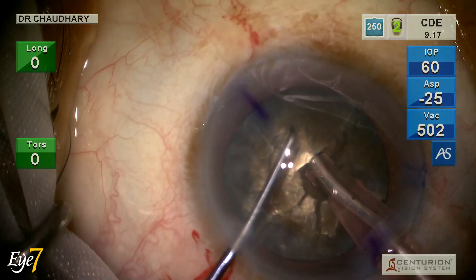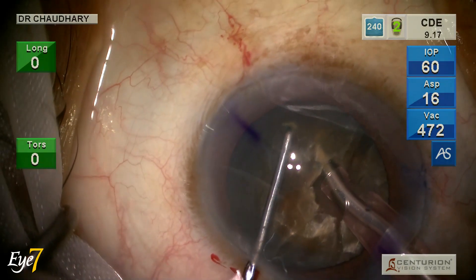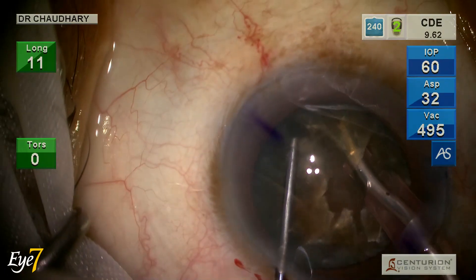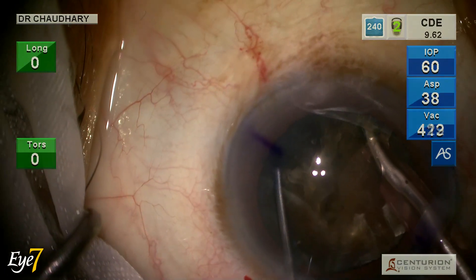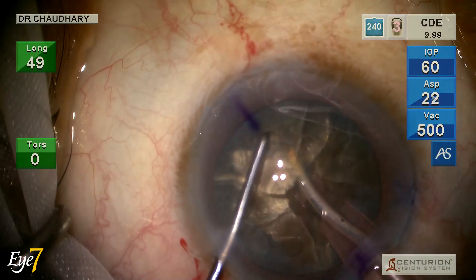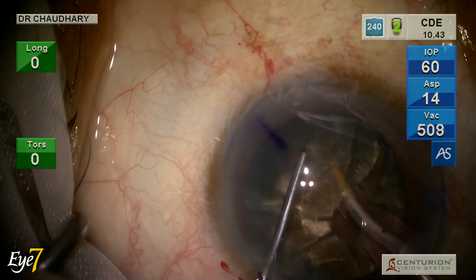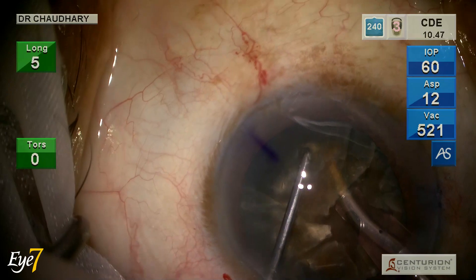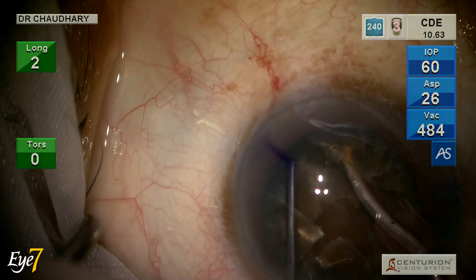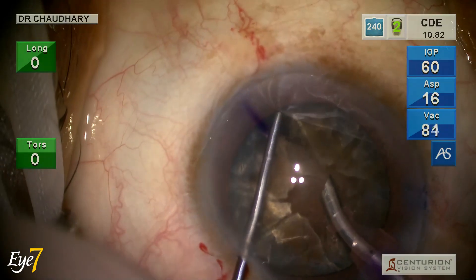Longitudinal phaco buries straight into the nucleus, and once I reach the edge I bring my foot pedal to position 2. At the height of foot pedal 2 I have maximum purchase and maximum hold of the nucleus. At this point I am not in foot pedal 3 — I hold at the highest position of foot pedal 2 to separate the nuclear pieces.